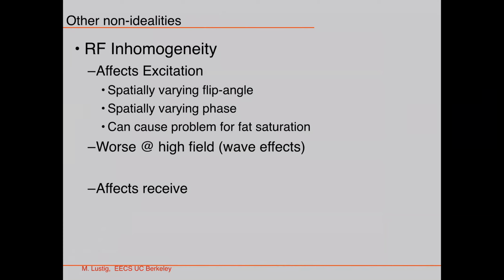I have a question. Is it possible to select multiple slices at once to speed up the scan? Oh, yeah. That's called simultaneous multi-slice, and there are good reasons to do that. First of all, the extreme would be to excite the entire 3D. Well, the thing is how you separate those slices from each other. So you have to do something about it.